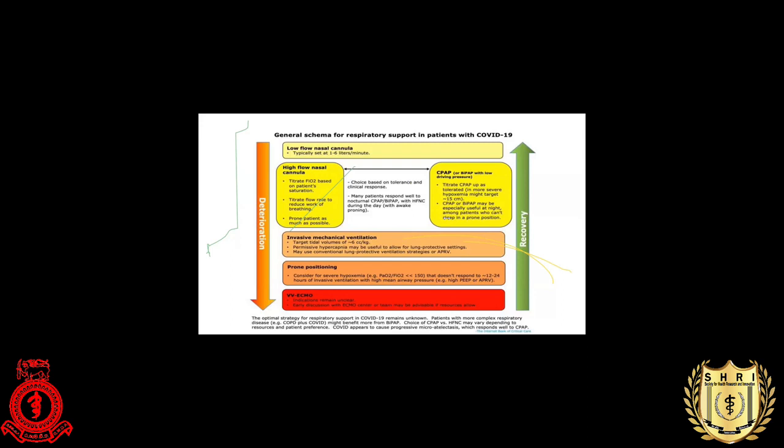Regarding this ResMed CPAP machine, the older version does not have an FiO2 sensor, so you can't check it. You have to go clinically and by the flow rate. There are some newer versions which have an FiO2 sensor and FiO2 reading as well. So it depends on the model. You can go through the model's leaflet booklet, and if it doesn't say anything about FiO2 monitoring, that means you can't.